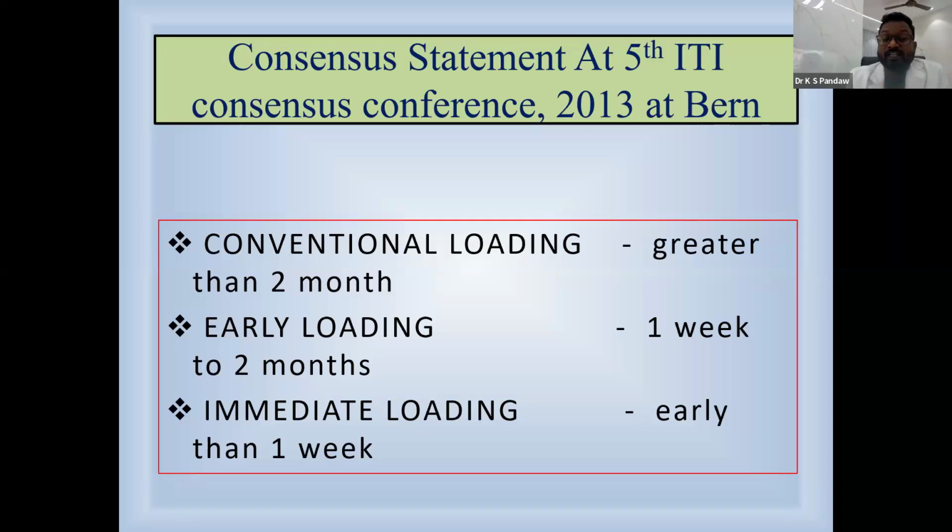If we are loading the implant within 1 week, it comes into the category of immediate loading. And if we load the implant after 1 week and before 2 months, before complete osseous integration, this comes under the category of early loading. And conventional loading is when we load the implant after complete osseous integration. Okay.